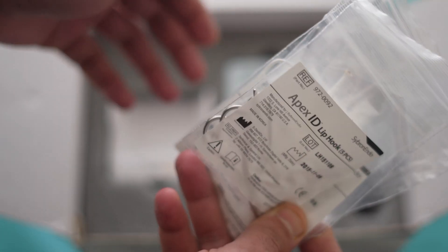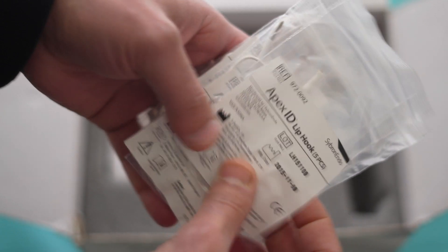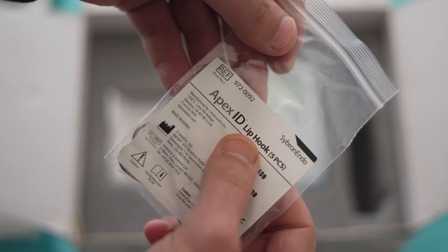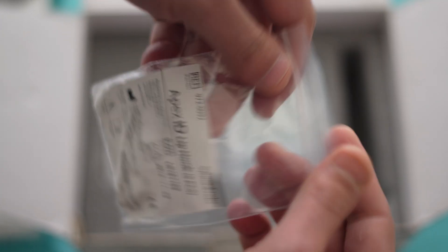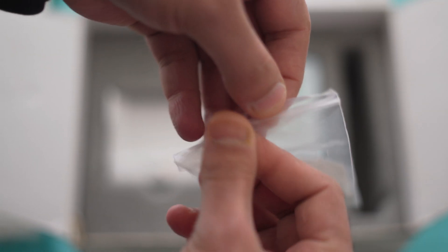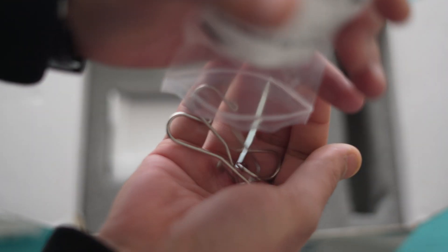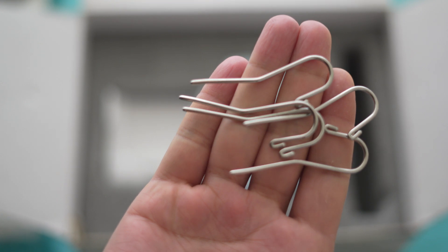The Apex locator also comes with different accessories. I will show you one by one. This is the Apex ID lip hook — they are five in number. These are the five clip hooks for contacting the patient's lip.